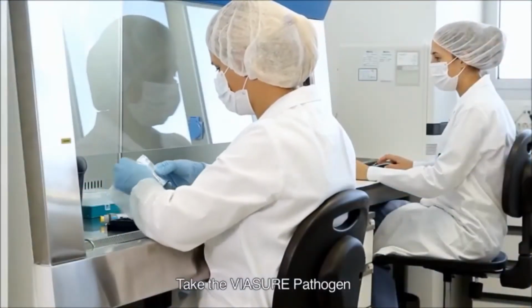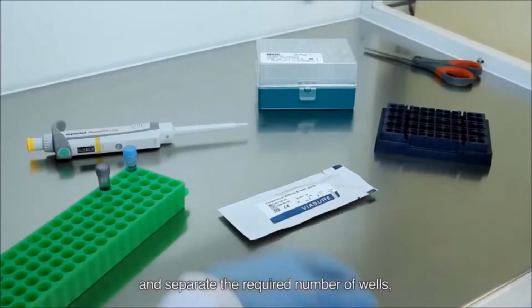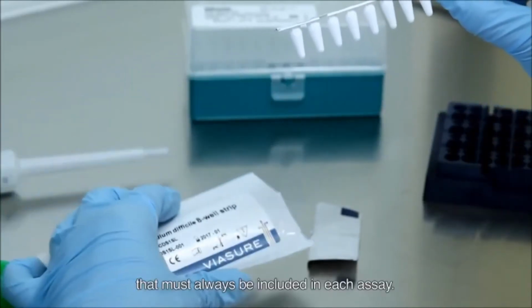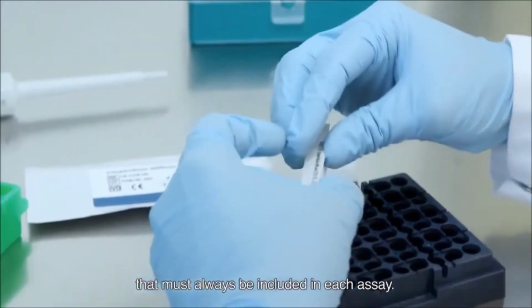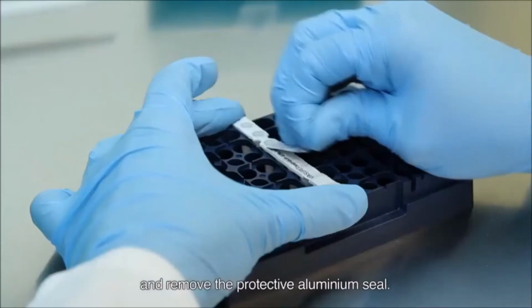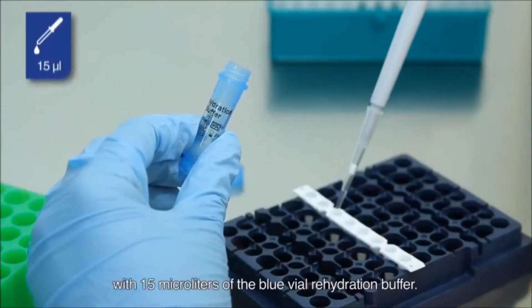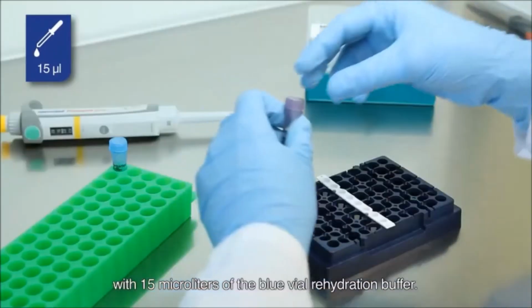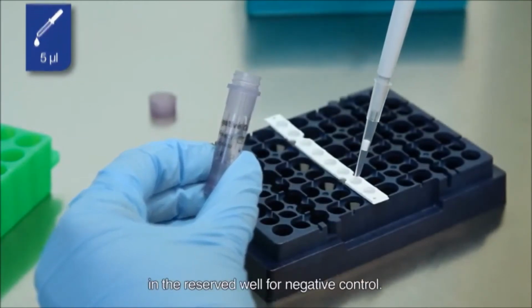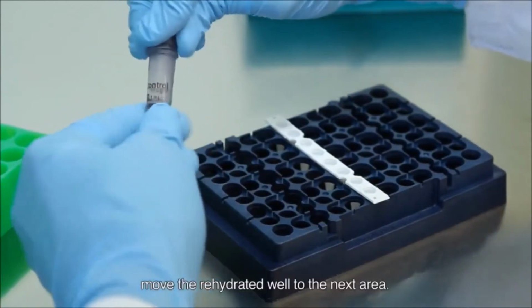Take the ViaSure Pathogen Real-Time PCR Detection Kit and separate the required number of wells, including samples and 2 reserved wells, for the positive and negative controls that must always be included in each assay. If necessary, cut the required number of wells with the scissors and remove the protective aluminium seal. Reconstitute each one of the wells with 15 microliters of the blue vial rehydration buffer. Finally, add 5 microliters of the purple vial negative control in the reserved well for negative control. After this process, move the rehydrated well to the next area.